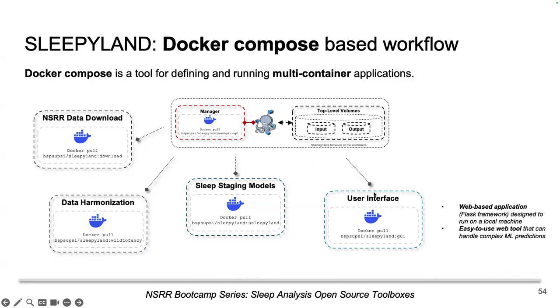Then you have this other container, which is dedicated only to the user interface. Just to mention, these are all independent containers, so they are running in parallel on our local machine, and they are able to speak with one another via the manager. The UI we are exposing is just a Flask framework that has been designed to run on a local machine. So again, local machine. All the data that you upload, your own data, will never leave your laptop. This is important because, I mean, we all know the problems with clinical data.